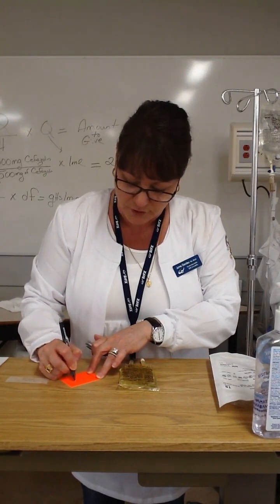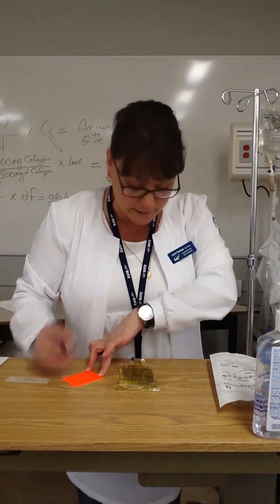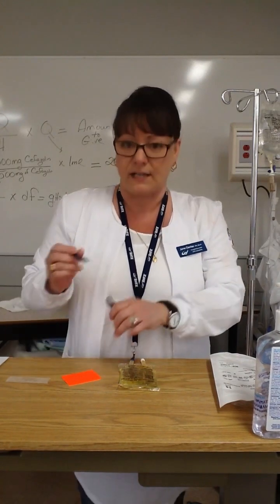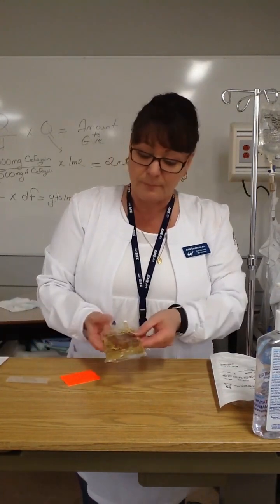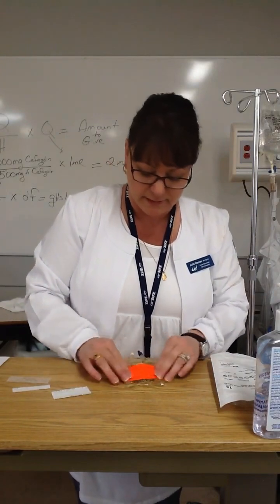And I'm going to put the drug and the dose and the date and the time, my signature and designation, and of course that second nurse signature and designation would follow. And I'm going to flip my little mini bag over because we never apply the label to the front that designates what this fluid is. We flip it over and we put it on the back, and fix that to the back. Okay, so that's all ready to go and safe.